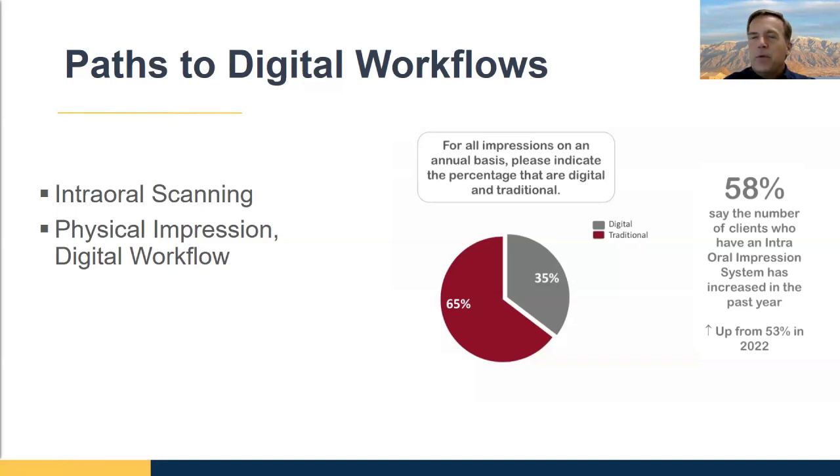Again, I kind of mentioned this before, but you can use a custom tray workflow, a custom tray impression today, and get a digital denture just the same as your colleagues that have an intraoral scanner. So don't feel like that's a barrier. So when I put it all together, I'm going to have 5 different workflows. So I'm going to go through the immediate denture workflow in detail. I'm going to go through the reference denture workflow in detail. And then otherwise, I'll talk about kind of what you change from those for the other 3.